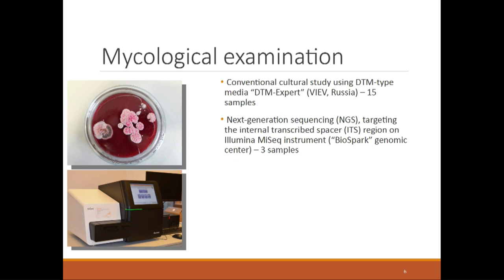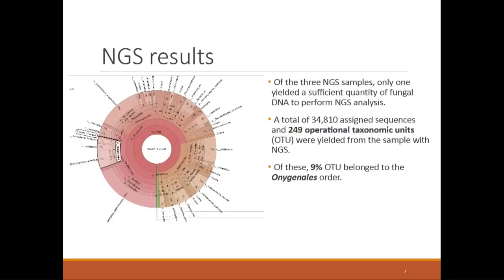Okay, the mycological examination was performed using both conventional and NGS metagenomic approaches. The conventional approach included cultural study of samples on Sabouraud and DTM-type media with subsequent identification of isolated cultures. And another portion of samples was subjected to metagenomic NGS sequencing targeting the ITS region on Illumina MiSeq instrument, and this metagenomic study was performed in the Genomic Center.